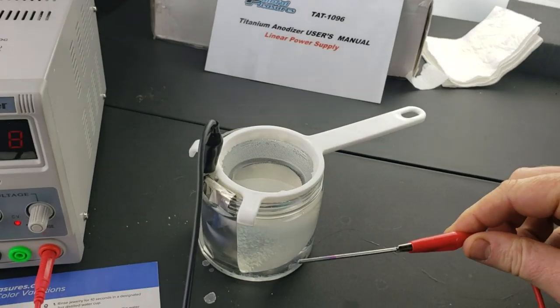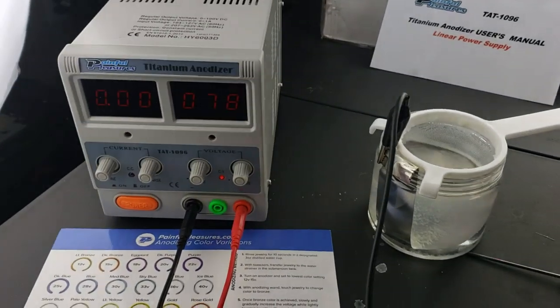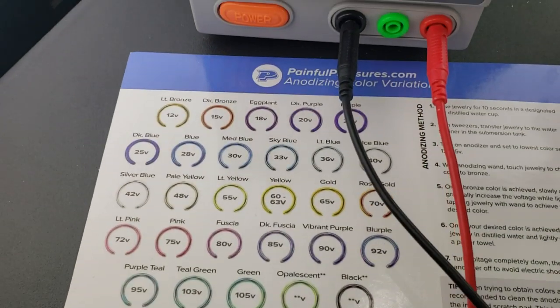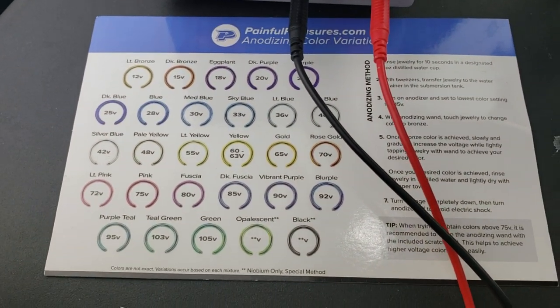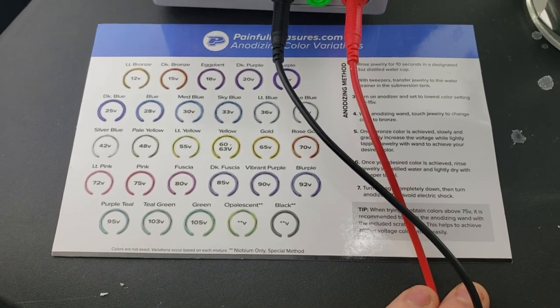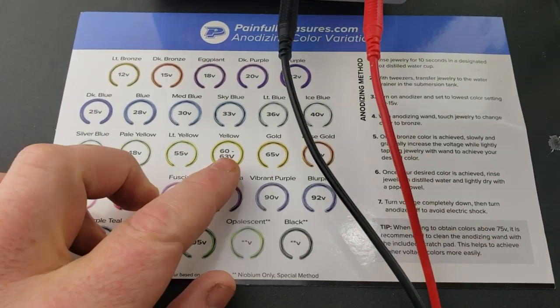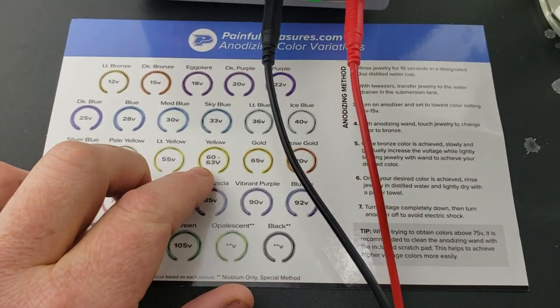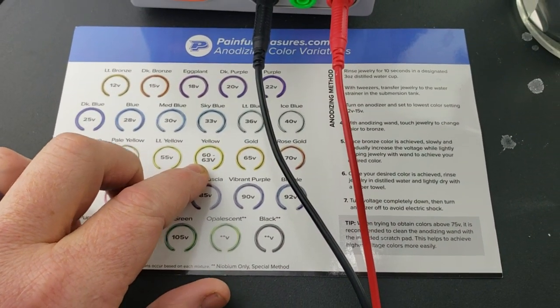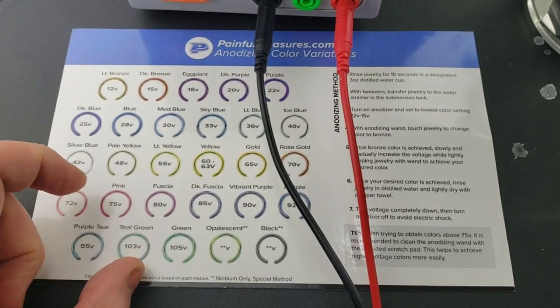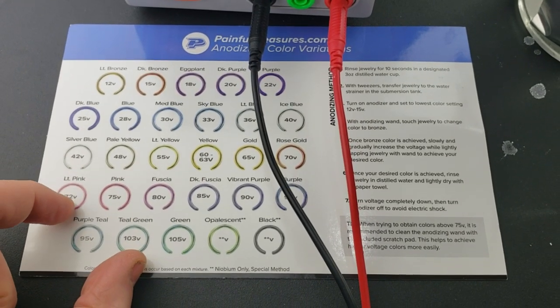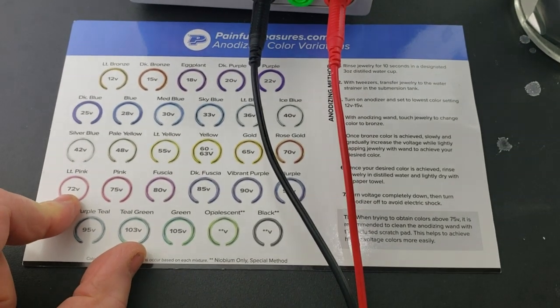You can see on here the colors of the various voltages and what they're going to yield when you put the titanium in there. I'm going for this gold color with the crown portion and this pink with the remainder.